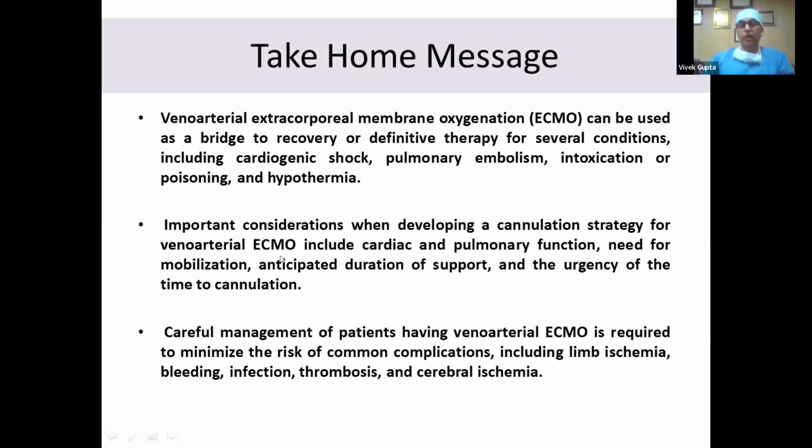Everything has to be taken into consideration because if there is an urgency and we are in a CPR situation, we can go for percutaneous cannulation, but if we have time, probably the open technique may be a better one.